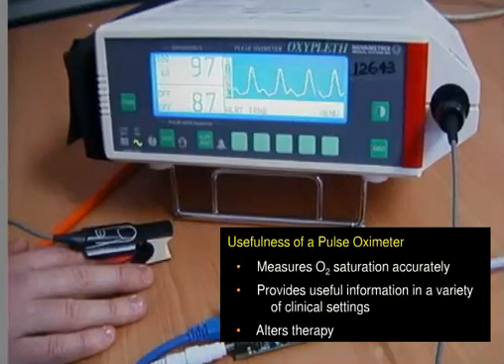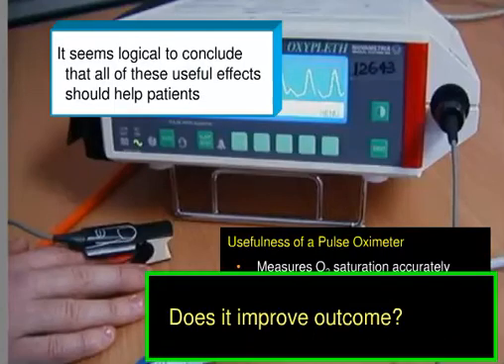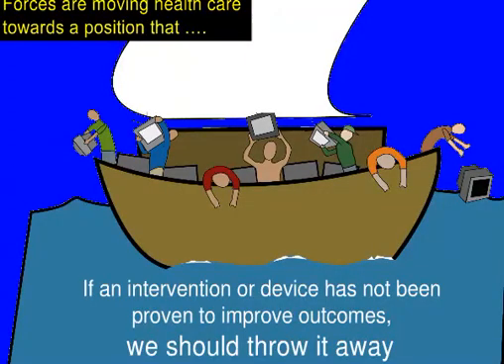So I just finished showing you how useful pulse ox is. It measures oxygen saturation accurately, it provides useful information in various clinical scenarios, and it can even alter therapy. So it seems logical to conclude that all these useful effects should help patients. In other words, it should improve the outcome. And forces are now moving healthcare towards a position that if an intervention or a device has not been proven to improve outcome, we should just throw it away.